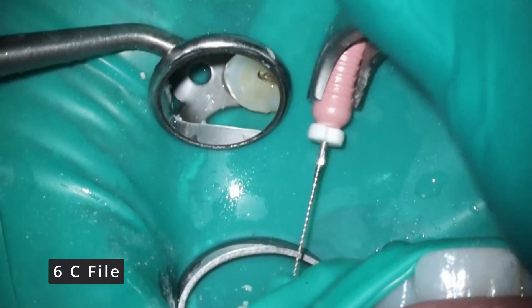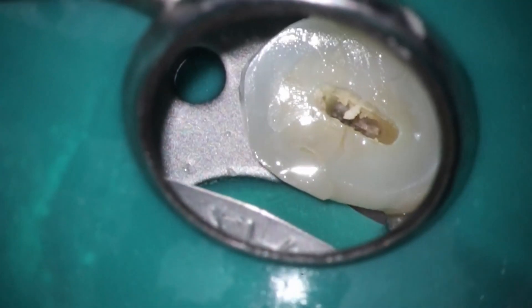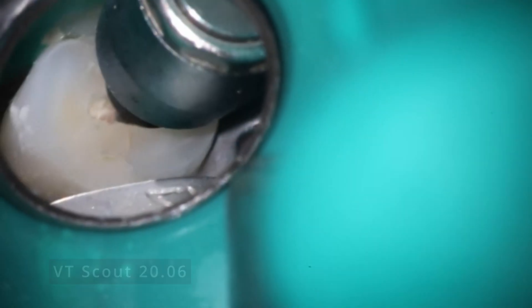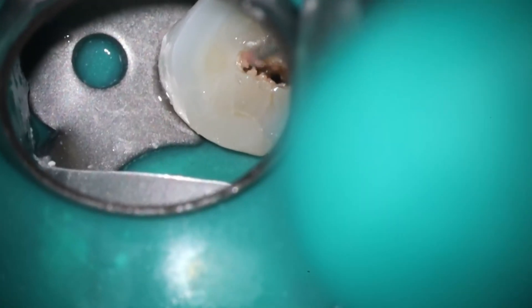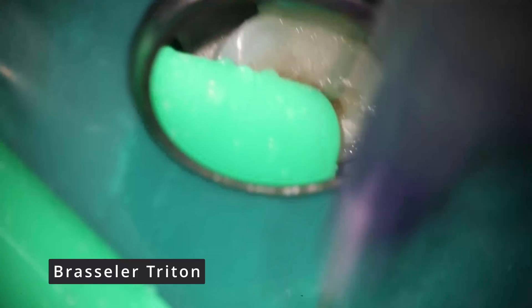Because I know this is an S-curve, I'm going to start with a 06C file and put a little bend on there. I generally use my fingers for a pretty large gross bend to start. I do have an endo bender for fine adjustments if needed. The tooth was necrotic, so I'm going to start with a 20/06, and it went to length. I know that video said I'd be scared to take it to length, but it gave me no resistance. There's your hand-filing follow-up — I was going to record it specifically for this commenter, expecting to do more hand filing, but it dropped to length. So the rest of the video is going to be a pretty traditional root canal, done quickly.